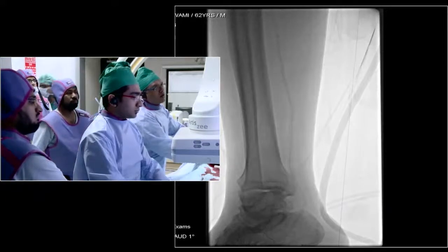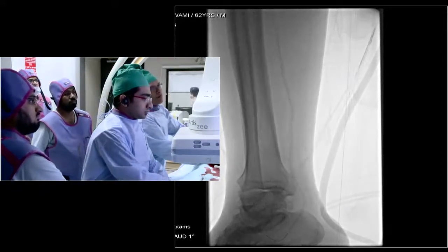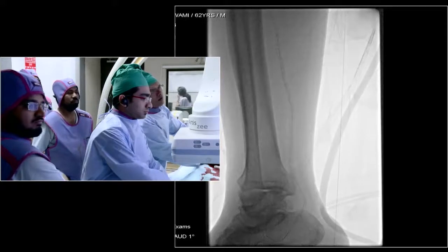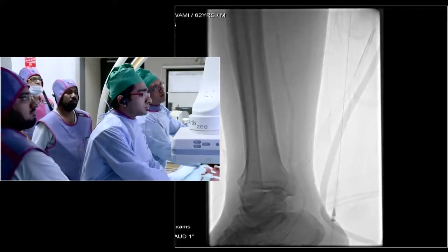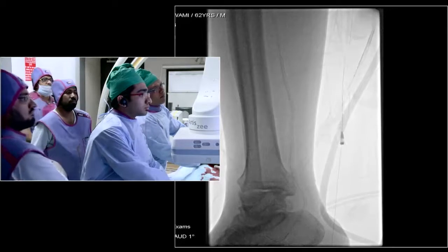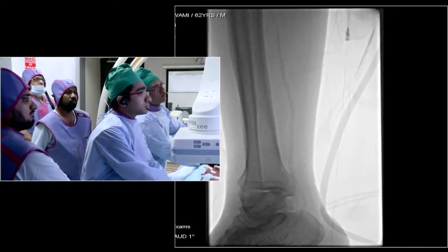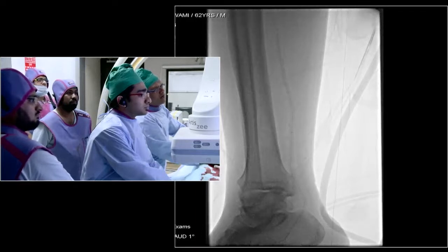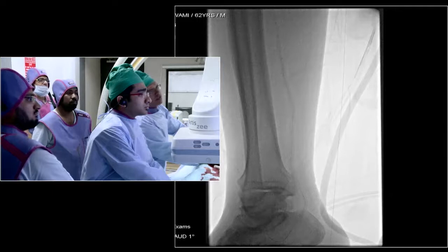I can see the wire in one of the plantar branches. We can stage the procedure — first treat the distal posterior tibial artery, and after that, if needed, we can go for the plantar artery revascularization.